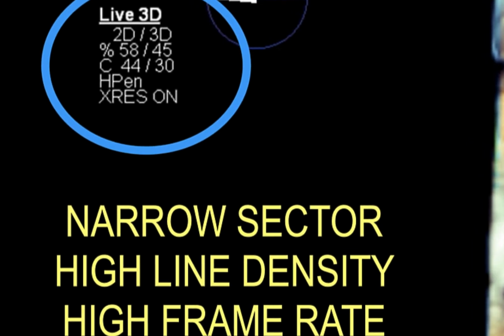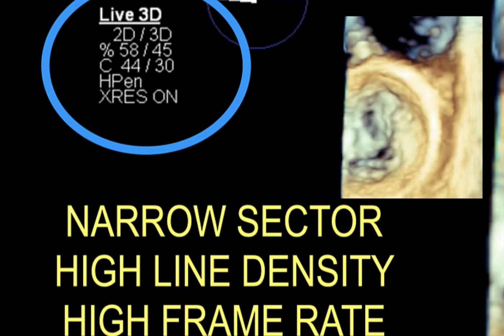Secondly, I have significantly increased the 2D and the 3D gain to see whether that artifact is covered up, and you do not see a perforation as well as we should have. A wide perforation generally should be visible even under these circumstances also. So this is the second tier of my knobology, or my image adjustments, which I did to sort out whether this was a perforation or a dropout artifact.